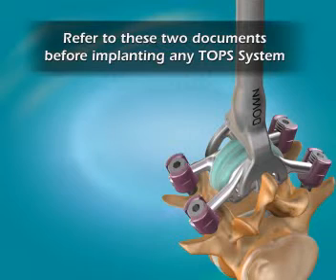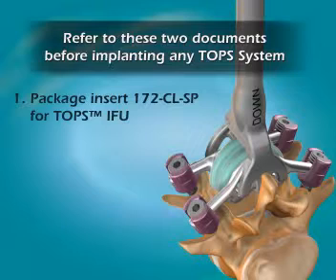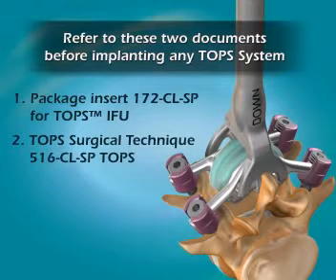Refer to these 2 documents before implanting any total posterior spine system. Package insert for TOPS 172 CL SP. TOPS surgical technique 516 CL SP.